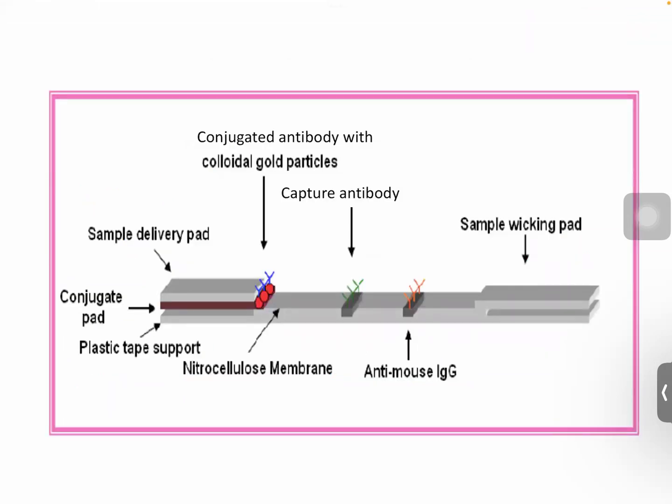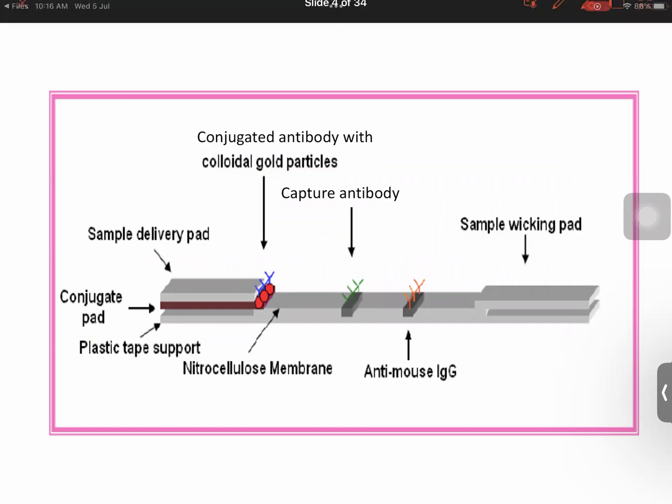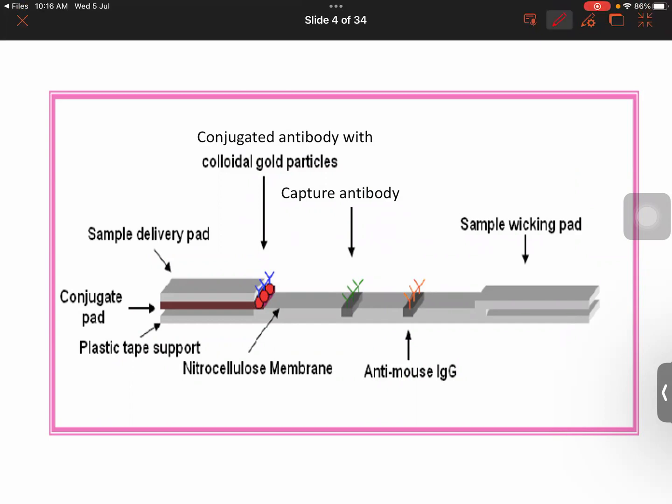And in detail, we have to be very careful about the bioreceptors. In this case, I'm referring to this as the detection bioreceptor. And this is the capture bioreceptor. So in using antibody, you have to be sure which is which. For example, this one, the detection antibody, usually we prefer to use monoclonal. And for the second one, which is the capture antibody, it is suggested to use polyclonal. For monoclonal, of course, it is much more expensive. So we have to optimize.